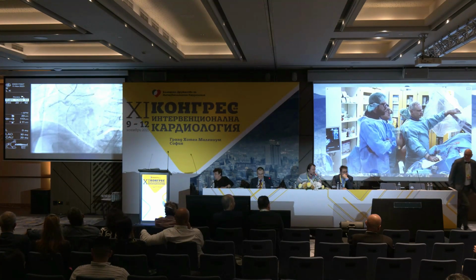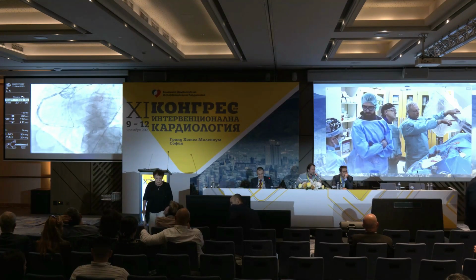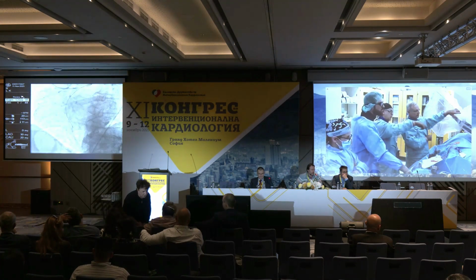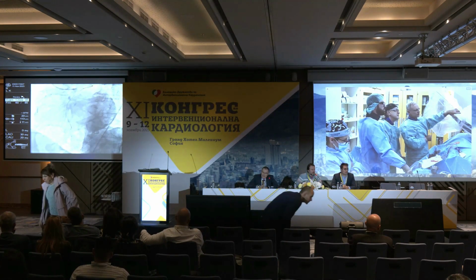Let's see. Here we have it already, Dr. Gelab. Yes, we have it. You see. We have it after, even before putting the second stent. Yeah, okay. We had it from the beginning. No, before even. Yeah. Go back. Yeah, it's there. Let's see here. Here we have. I didn't give contrast.